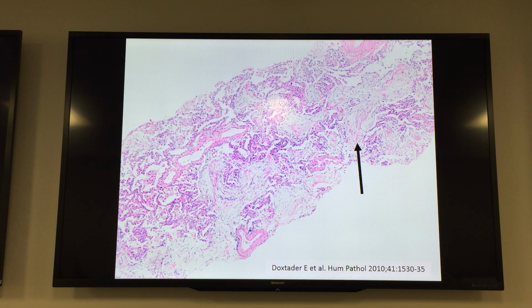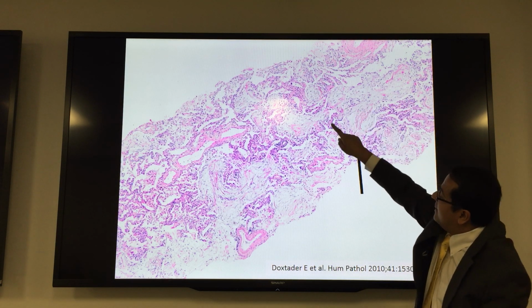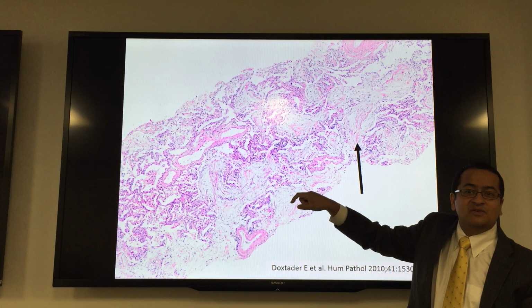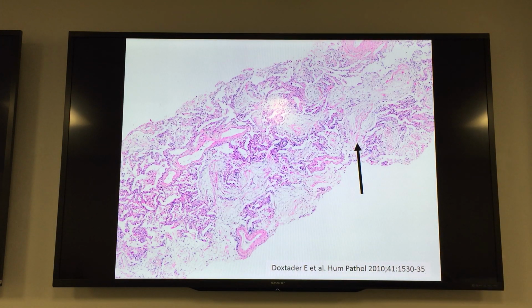Here's another picture with another specific diagnosis, although it's not a bug. Do you see this thing here branching like that? Anyone who's been on the lung service, do you know what this is? Organizing pneumonia. Plugs that branch in a serpiginous way, polyp-like plugs. Organizing pneumonia. Another diagnosis that can cause a lung nodule or mass, but actually is benign.